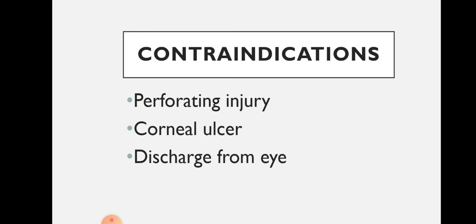But nowadays the immersion technique is becoming more popular than contact, because the immersion technique is more accurate than the contact method. In immersion we can get 6 echoes, and in contact we get only 4 echoes. The 6 echoes are 1 echo for the probe, 2 echoes for the cornea, anterior and posterior, 2 echoes for the lens, anterior and posterior, and 1 from the retina.